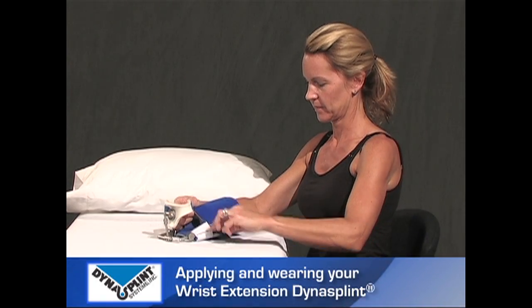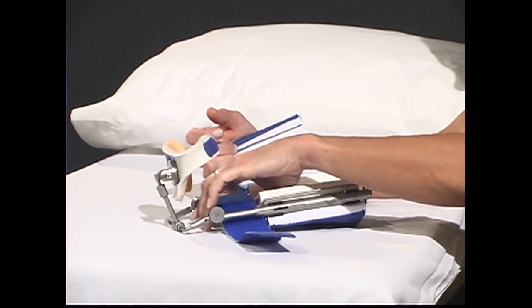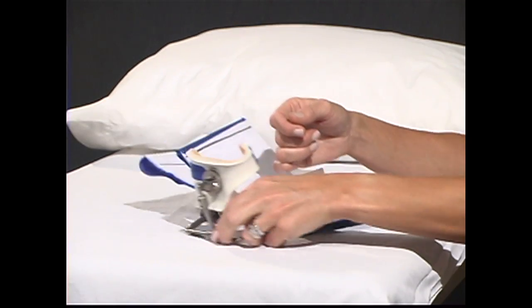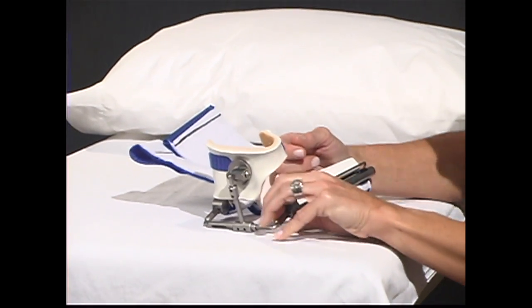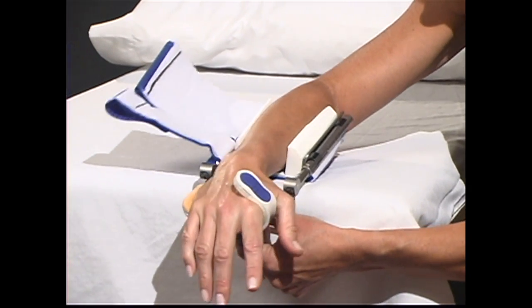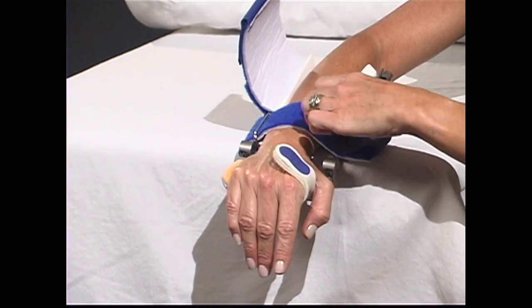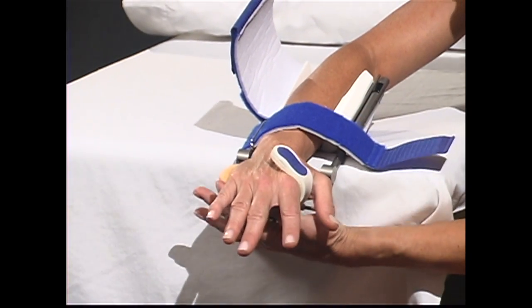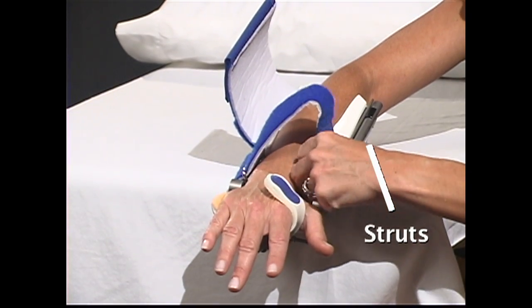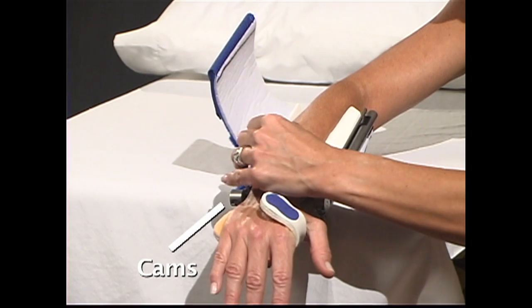While sitting at a table, open completely or loosen the top of the forearm cuff and strap. Hold the palmer piece section in the down position with the unaffected hand. Slide or lay the arm into the unit. The palmer bar should rest in the center of your palm. Align the upper and lower struts with the midlines of the sides of the lower arm. Align the cams with the wrist joint.